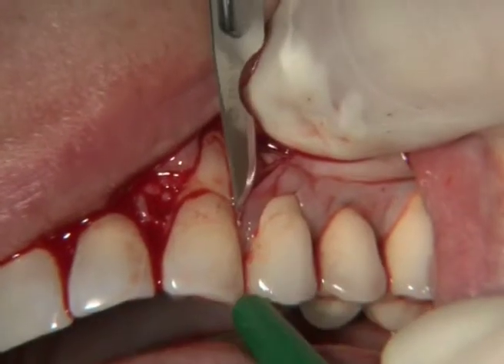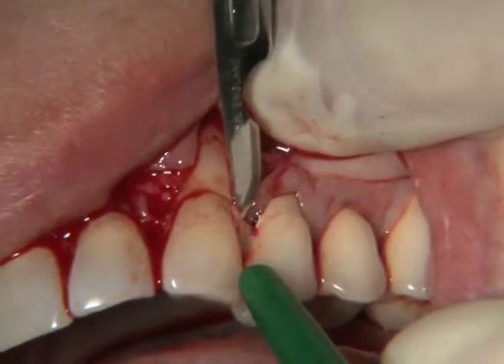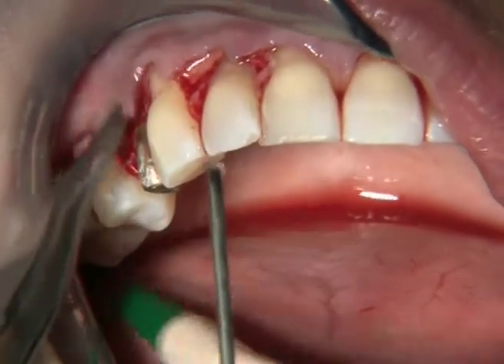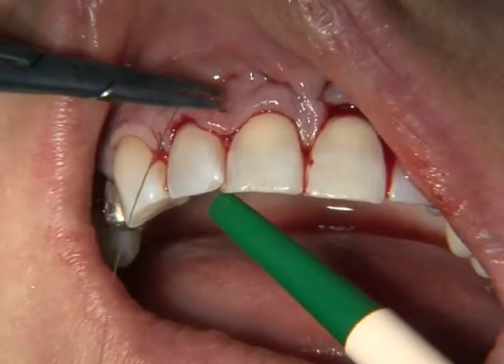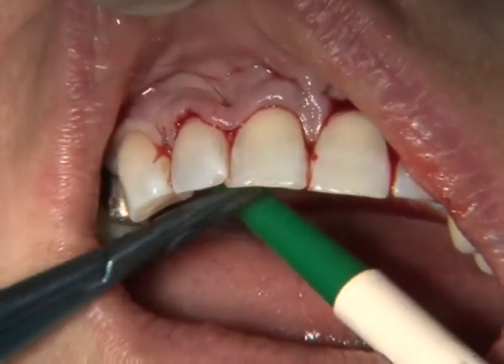It's very important here at the crown, just to remove only. It's very important to find out the correct position.